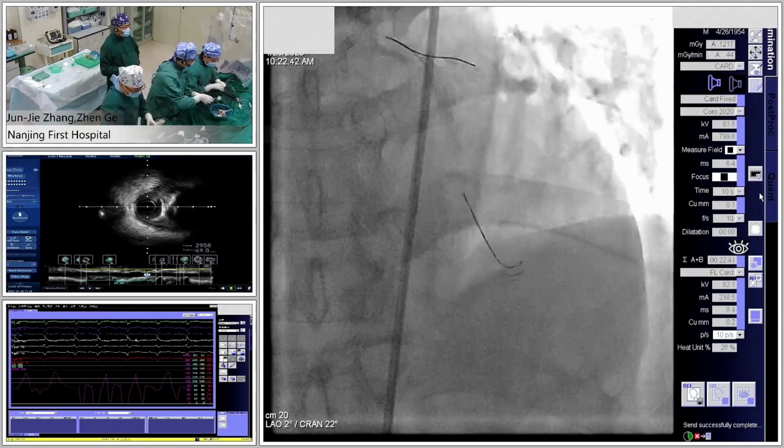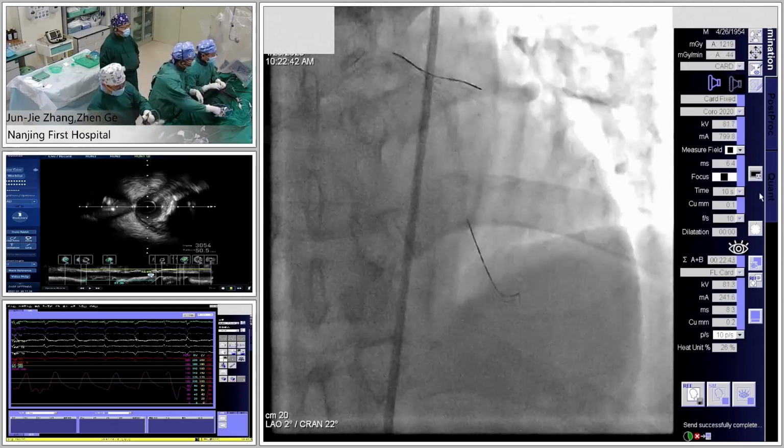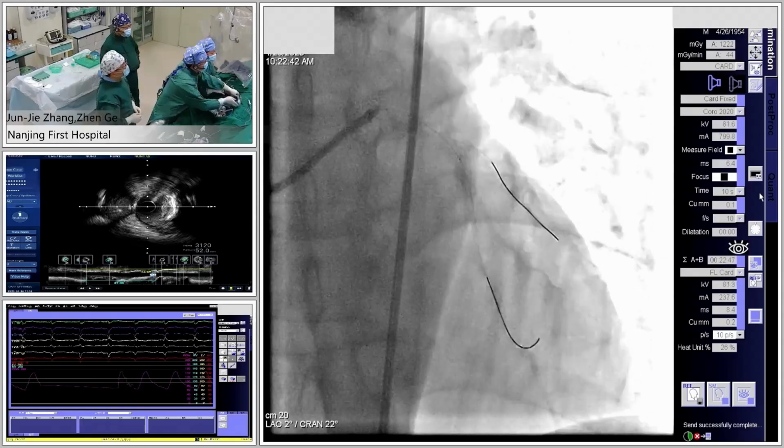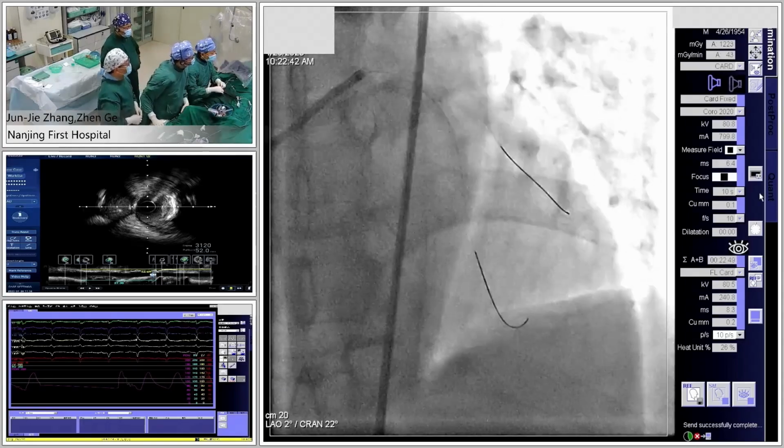Oh, sorry. Should be careful of the wire. I think we have enough time.